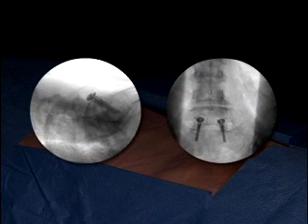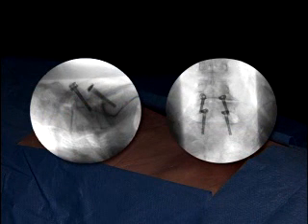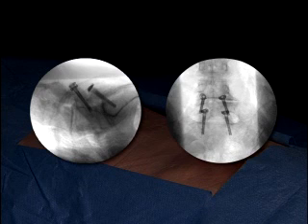Utilizing the same midline 15 mm incision, the contralateral side is fixated using the PERCUTANEOUS system. Lateral and AP views of multi-level fixation utilizing the same 15 mm midline incision with the PERCUTANEOUS system.